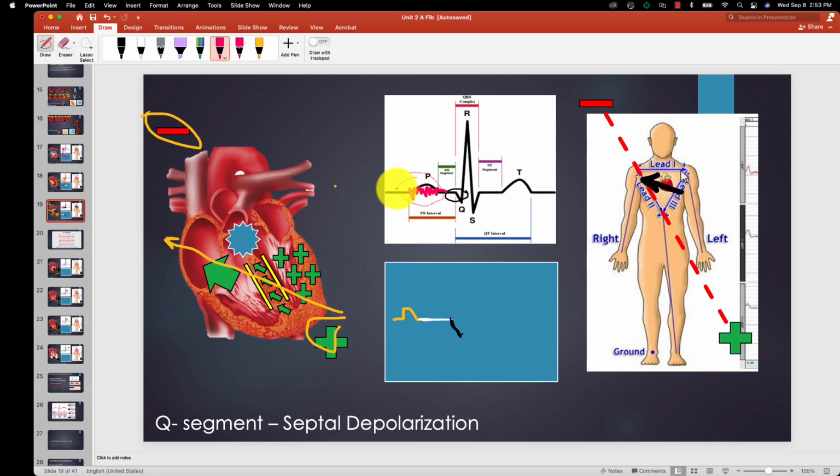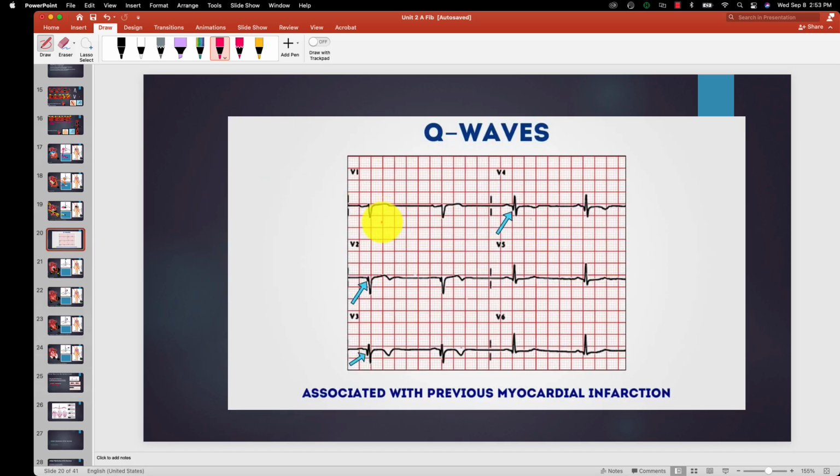So that's why I'm showing you this, so that you can see and understand how the heart's electrical pulses can tell the ECG what is going on and what it means physiologically, all right? And I'm just showing you here that these are some pretty big Q waves. So here's a Q wave here, and look how different this Q wave is from this one. This one's barely present. So here we have a little baby Q wave. Here that Q wave is even smaller. Here there's barely any Q wave at all. Here there's absolutely no Q wave.